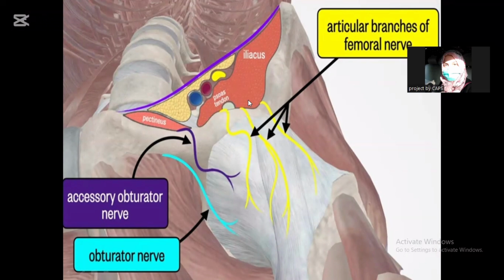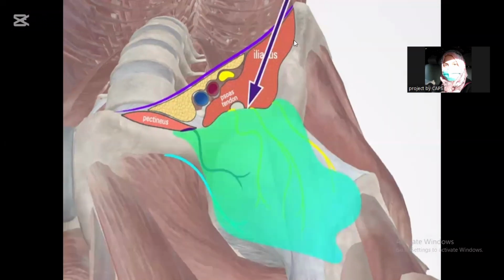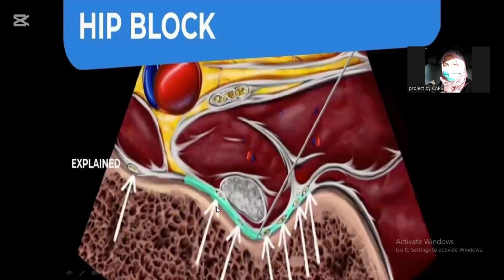So when you inject your drug over here, just near the psoas muscle, like this is the needle injecting the drug, it will cover all the nerves coming out beneath the tendon and over the rim of the ilium, like this again, as you can see. So this is basically the rim between the anterior inferior iliac spine and the iliopubic eminence. This is the iliopsoas tendon, this is iliacus. Giving the drug beneath this, it will start rising and spreading, and it will numb all the nerves.